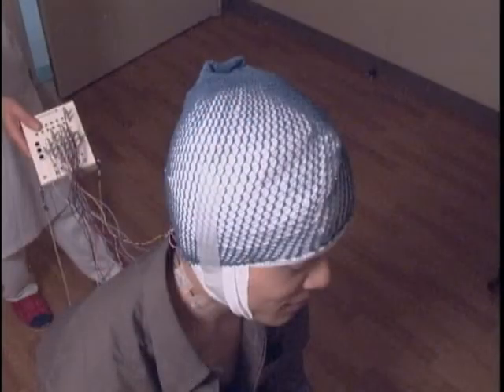Finally, attach the electrodes for electrocardiogram, ECG, and electromyogram, EMG. Electrodes attached to the left shoulder, left neck, etc. can record ECG and EMG simultaneously. These are convenient positions. If we know which part of the body the epileptic seizure usually starts, then attaching electrodes to this part of the body will tell the start of a seizure. When recording during sleep, it is necessary to install electrodes to record EMG of the chin muscle and eye movements as well as respiratory monitor.